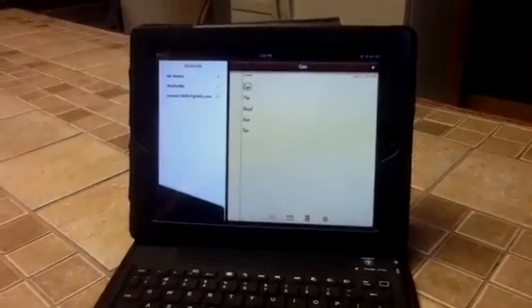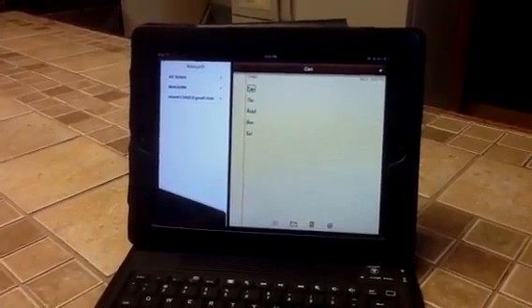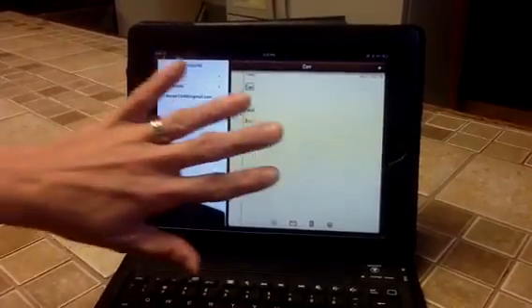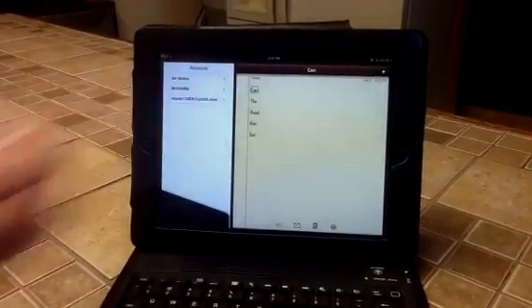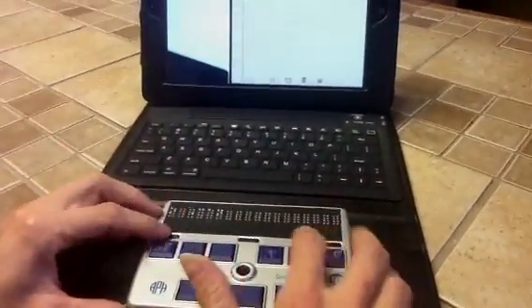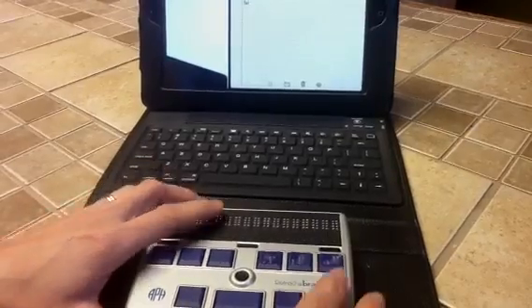So I'm going to disable the speech on VoiceOver. It doesn't turn VoiceOver off, it simply makes it stop talking. In order to do that, I'm going to take 3 fingers and tap twice. Speech off. It merely says speech off. Now I'm at the word can, and can will be displayed on my Braille display, and you'll notice that it says capital C-A-N for can.